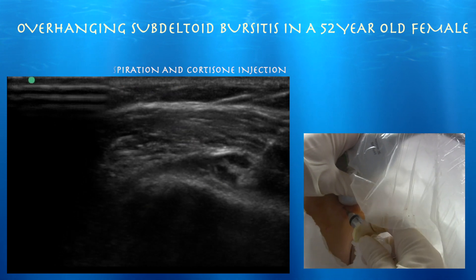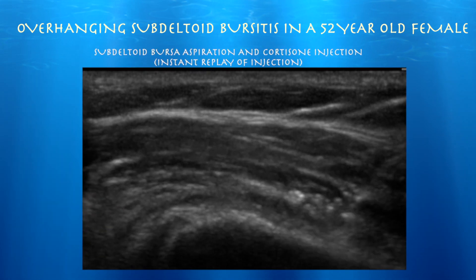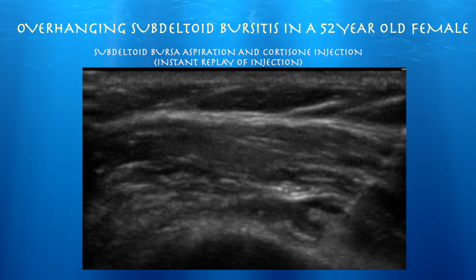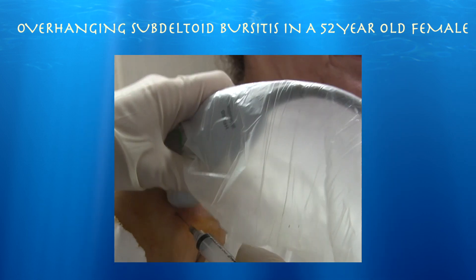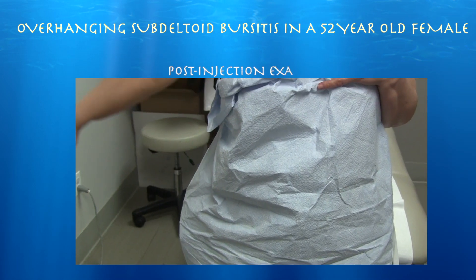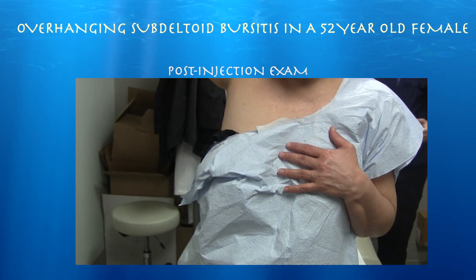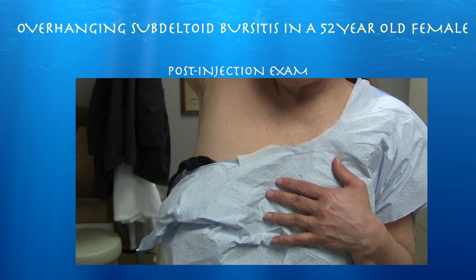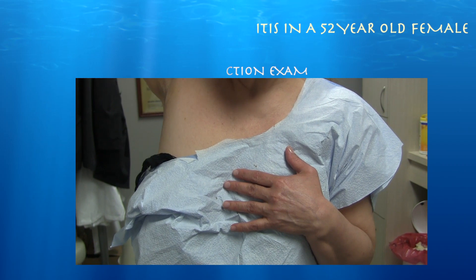You can see how the injectate travels proximally. Again, initially the injection was a little bit superficial, but then I quickly advanced the needle further deep and it was within the subdeltoid bursa that was overhanging the greater tuberosity. We injected her with lidocaine and methylprednisolone. Less pain — okay, great.